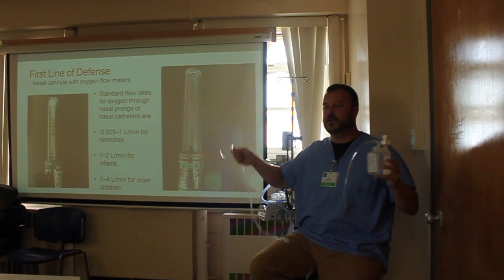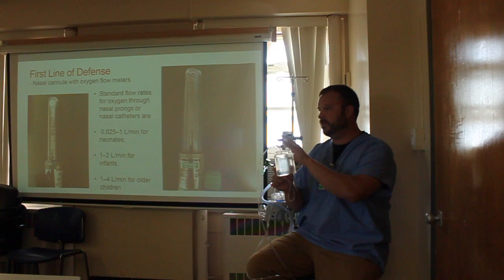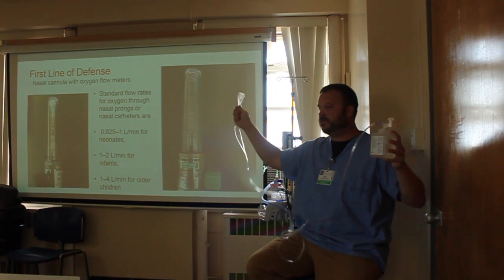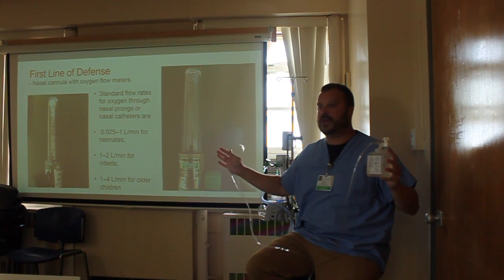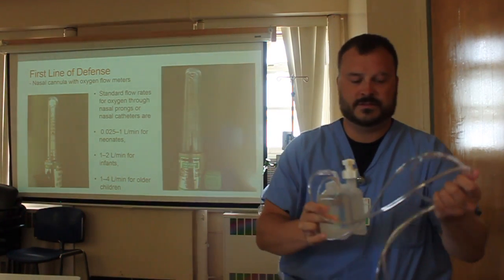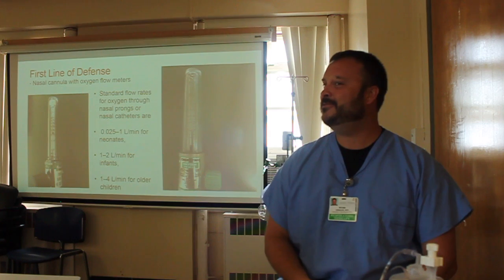But what you have to be aware of, regardless of what size cannula or what patient, if you put this thing through or over 6 liters, eventually we're gonna have like a wet t-shirt contest because this bad boy is gonna explode all over everybody, okay? So nasal cannula to this, 6 liters, that's your max, don't go any higher. Sound good? Okay. Going higher than that. I know. Say what? I said, I hope we're not going higher than that on the floor. Correct, and we're gonna get there. Although you say that, but I visited and been like, what are we doing? What are we doing here, right?